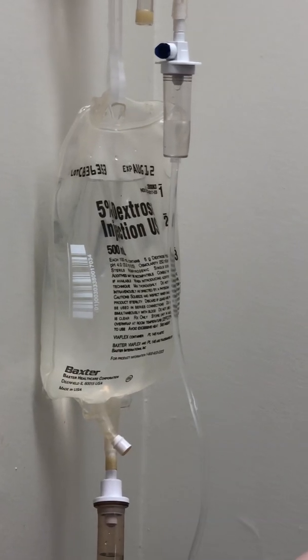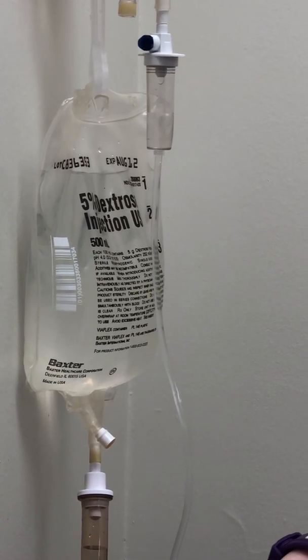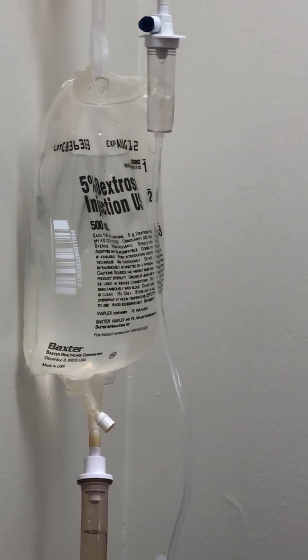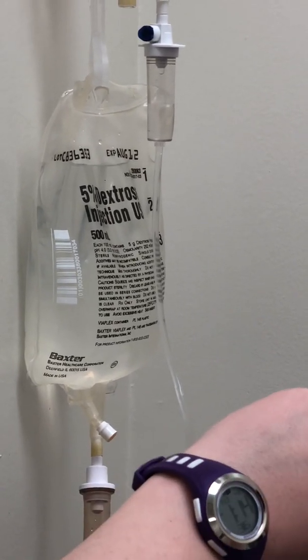Make sure it's right. Count my full minute again.